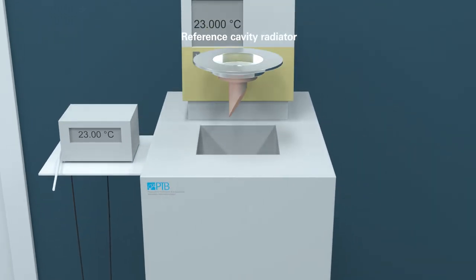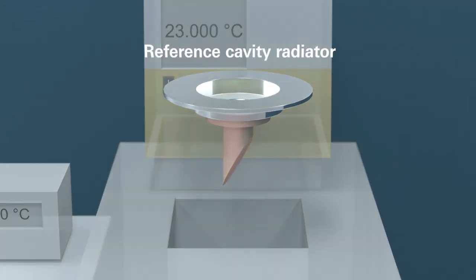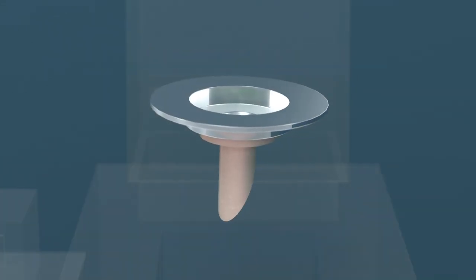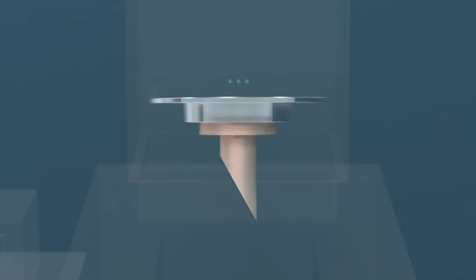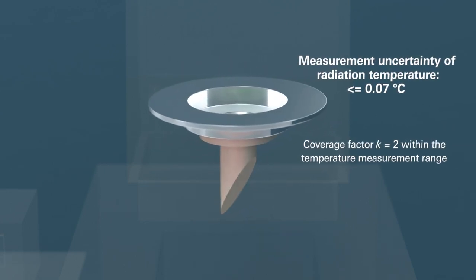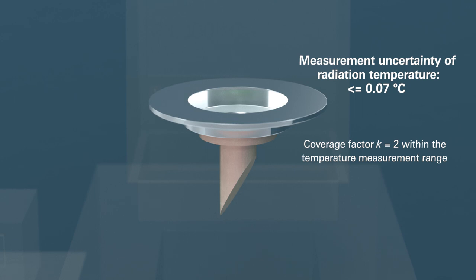Finally, you will need a reference cavity radiator. This is a black body which will be immersed in the reference water bath. The measurement uncertainty of the radiator's radiation temperature must not be greater than 0.07 degrees Celsius for a coverage factor of 2 within the temperature measurement range.